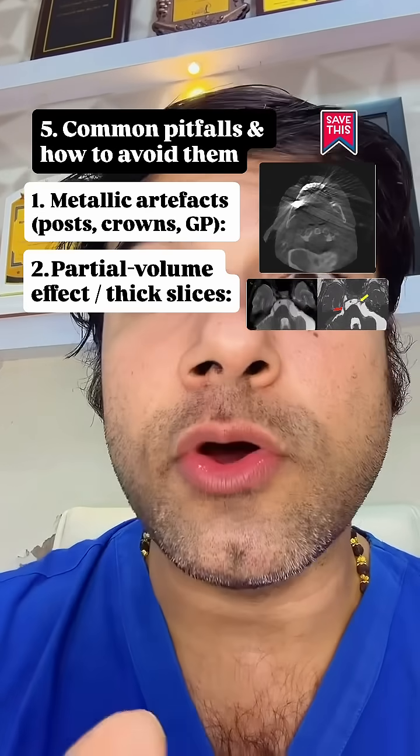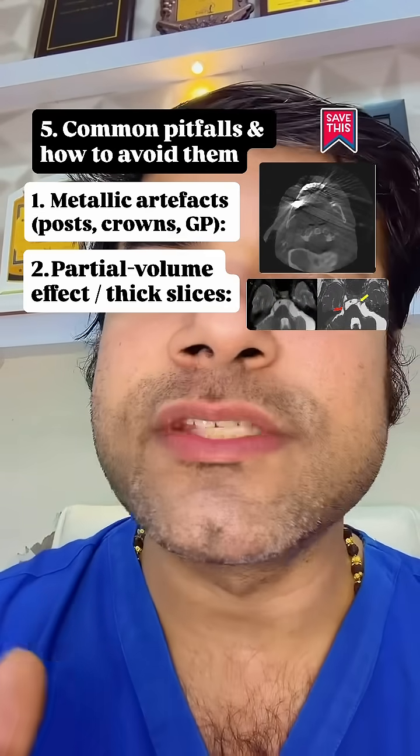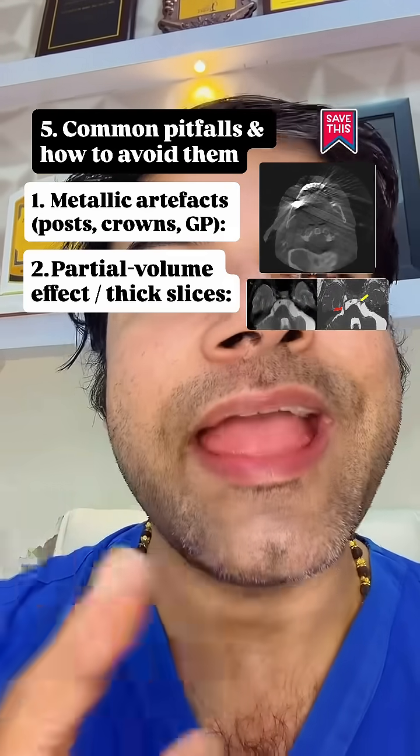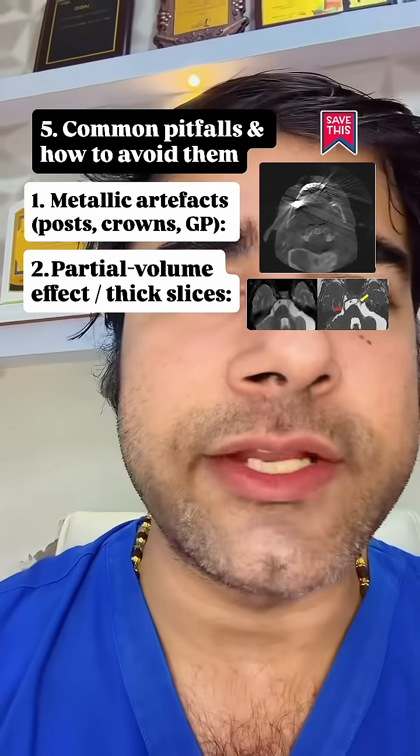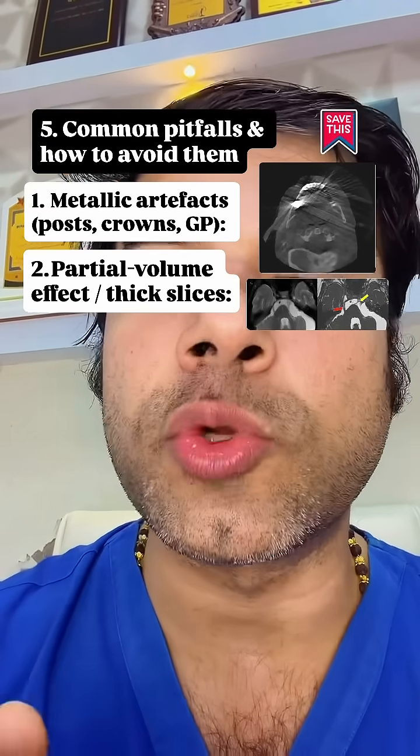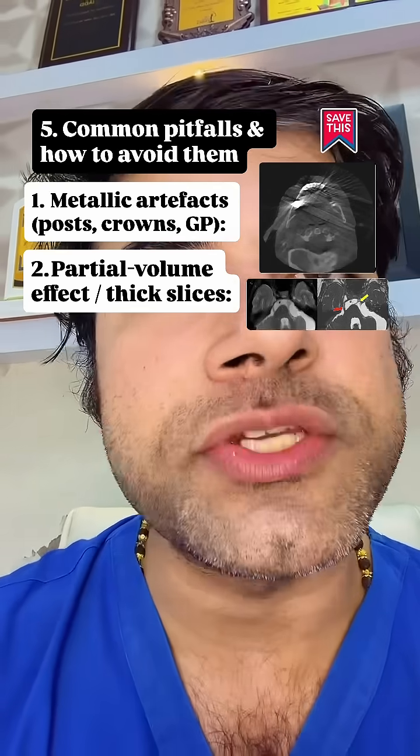Partial volume effect or thick slices. Large voxels, which are greater than 0.3 mm, may average out a narrow fracture, which is a false negative. Use a high resolution protocol where vertical root fracture is the question.